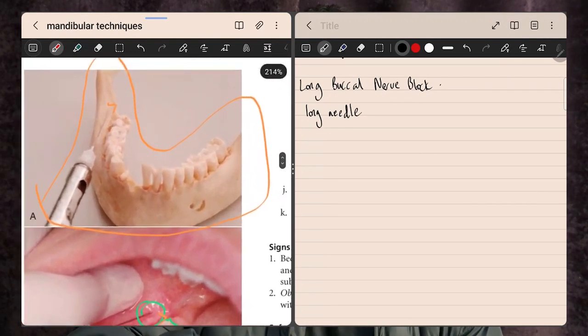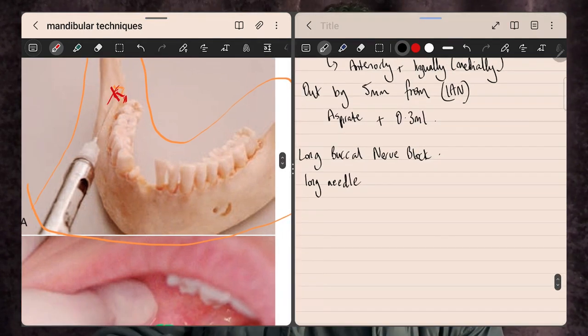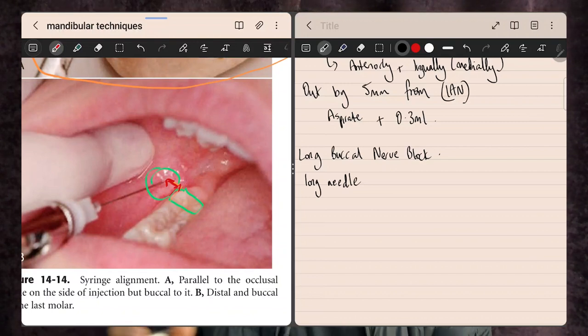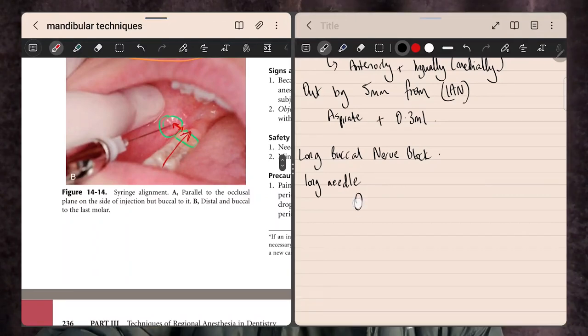From a bony perspective, we are posterior and buccal to the last tooth. On a patient, the needle goes in posterior and buccal to that final molar, on the same plane as the occlusal plane of the lower teeth — so the needle should be going in at the same height and flat plane as the chewing surfaces, not angled up or down. Inject 0.3ml and you should get the result you're looking for.